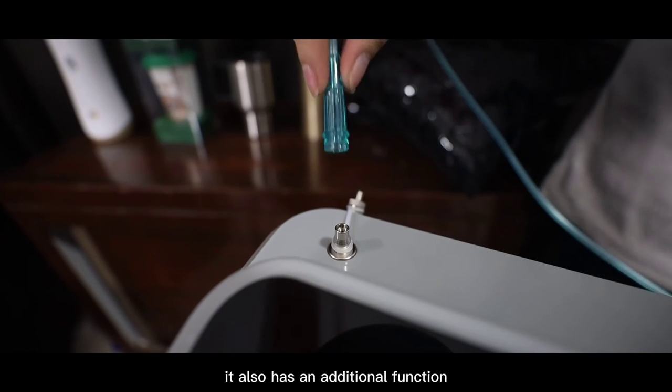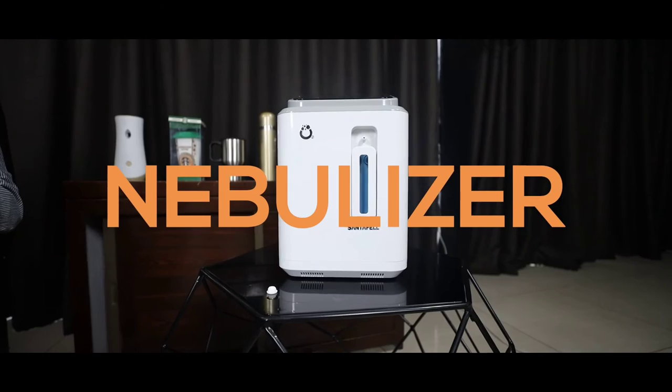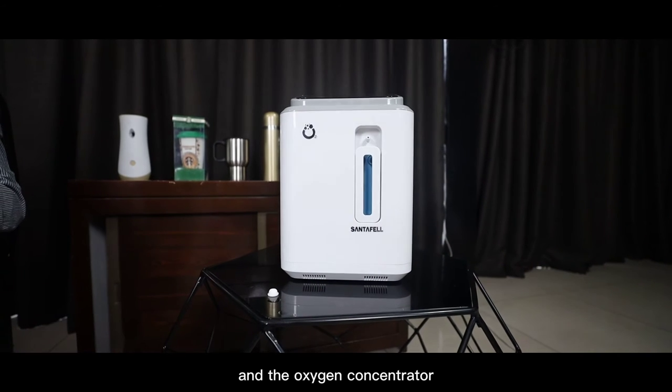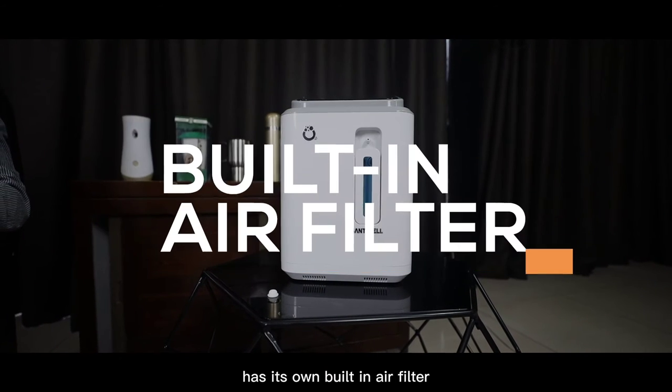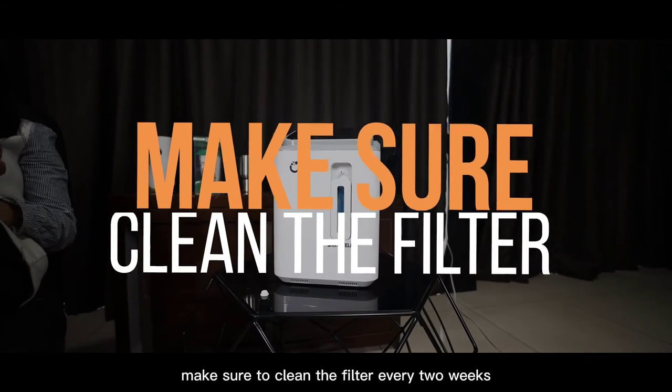It also has additional functions, such as a nebulizer. The oxygen concentrator also has its own built-in air filter. Make sure to clean the filter every two weeks.